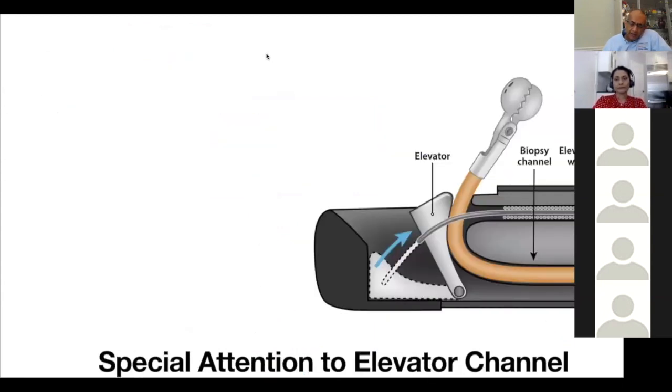So let's look at ERCP scope and EUS scope. And if you look at this elevator channel, the elevator channel actually revolutionized GI endoscopy. When they created the elevator channel, they were able to help patients that would have otherwise required surgery, like, for example, gallstone patients or patients with pancreatic disease.